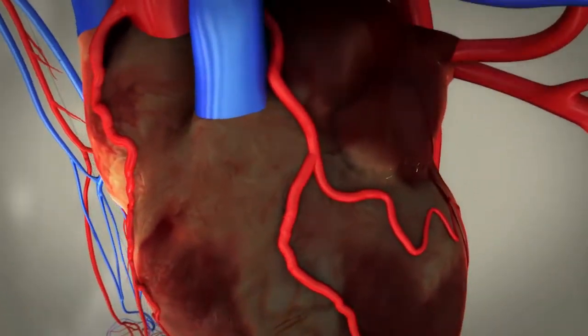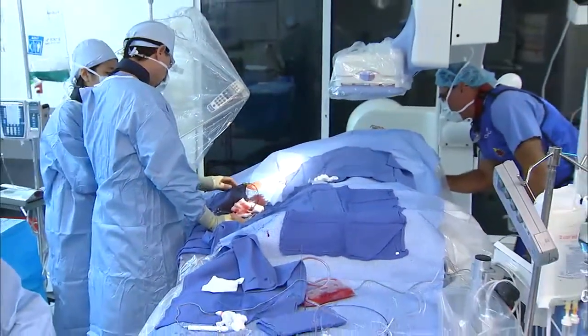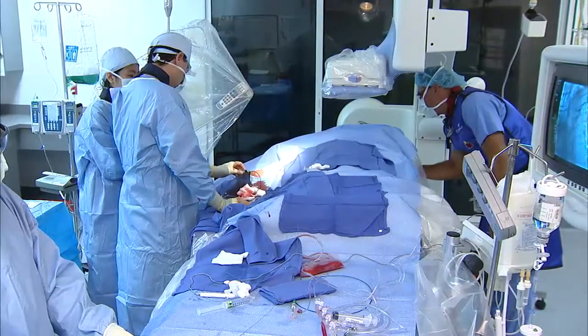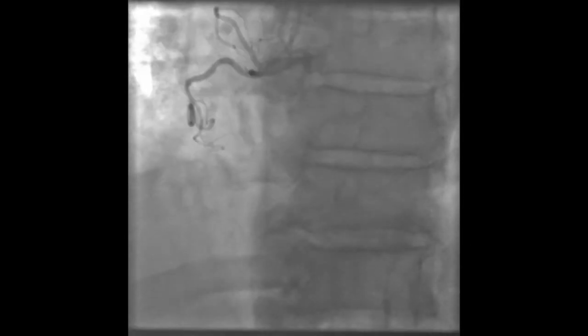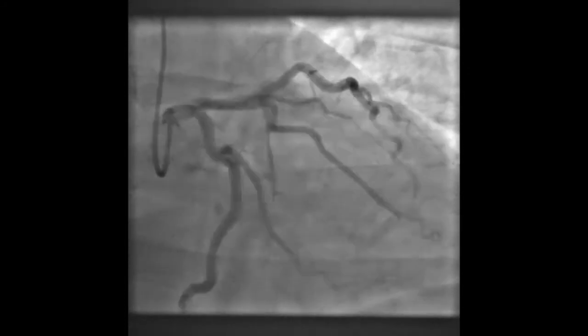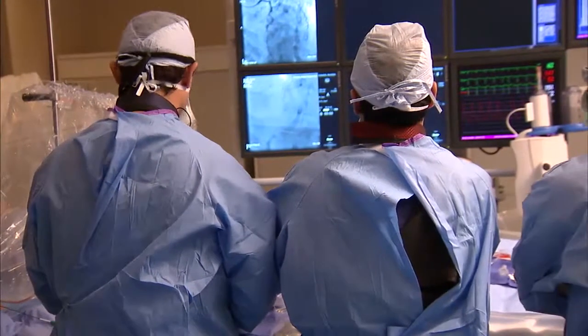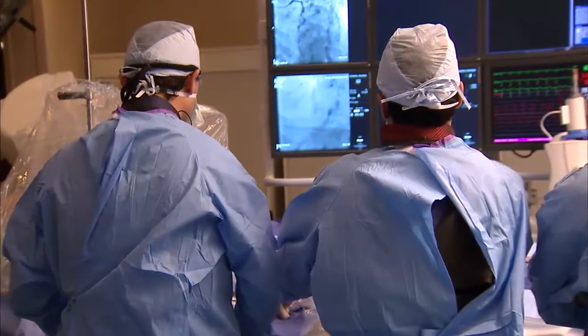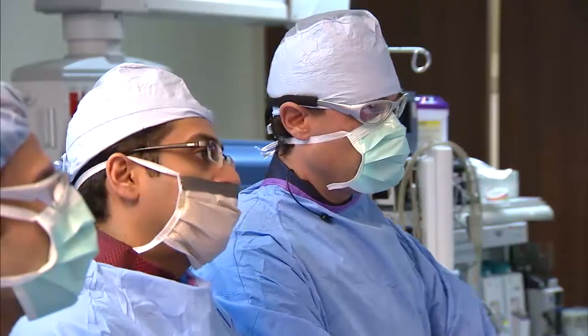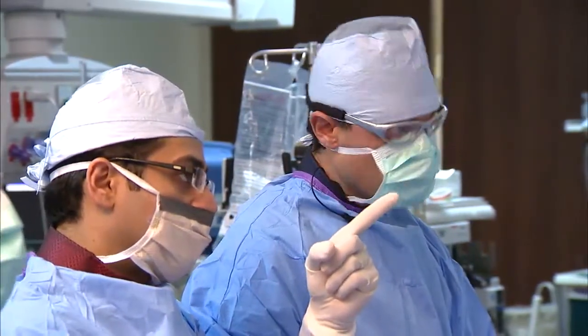Your doctor can determine the extent of the plaque inside your arteries by performing a procedure called an angiogram or cardiac catheterization. An angiogram is an imaging technique that uses X-ray technology together with a special fluid called contrast dye to obtain real-time moving pictures of the blood flow in your arteries. These images can help your doctor identify the exact location of any narrowing or blocked arteries and can also show the degree of plaque buildup.